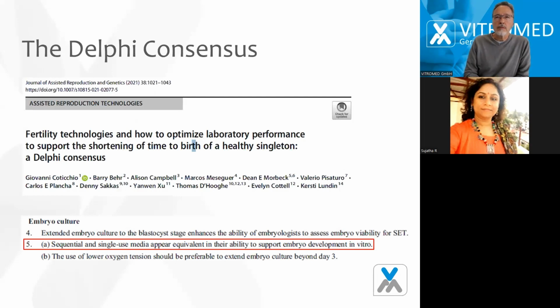Okay, this is a thing I want to show you. This is the Delphi consensus. It's from 2021, and this is based on or was initiated by a group of really famous IVF experts. You can have the names here. They sat together and discussed the single steps, the work steps, in IVF, what is good, what is not good, and so on.